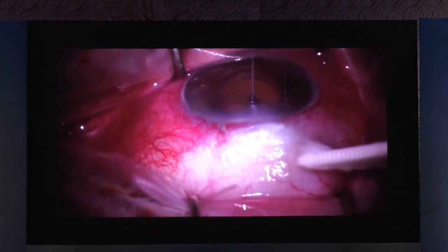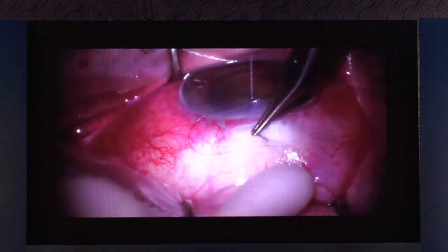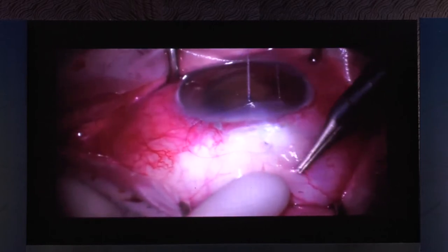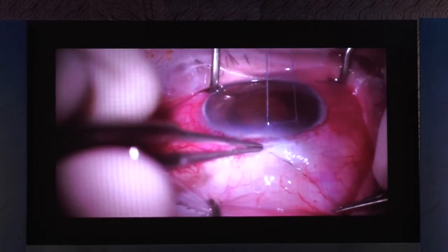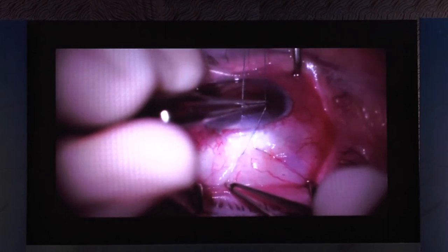The concern about blebs being too thin, somehow it doesn't feature. And there are studies that are published that the leak rates are not high. In fact, there's hardly any leak rates. Even in my own hands, I've done maybe 3 of this so far. Not too many, to be honest. What happens is within 1 week, this transconjunctival suture gets buried under by itself, and the conjunctiva epithelializes over it. So it's quite surprising. So I don't need to bury the knot. I leave it as it is.